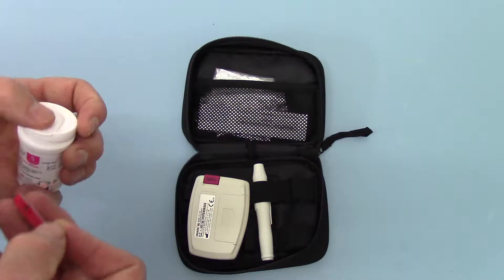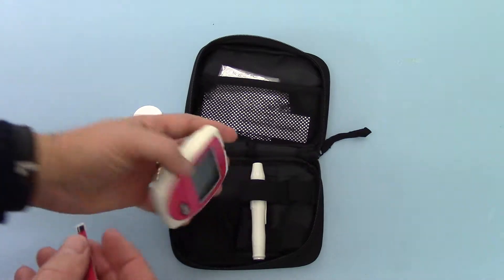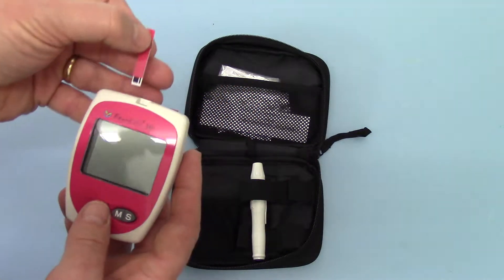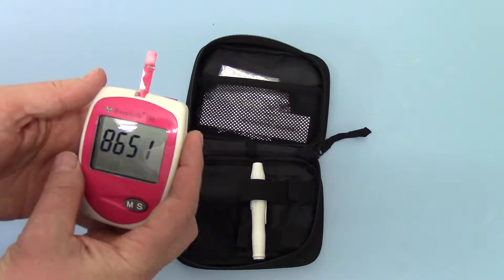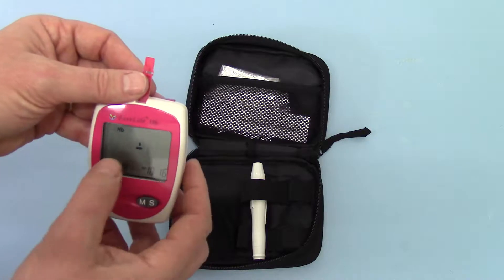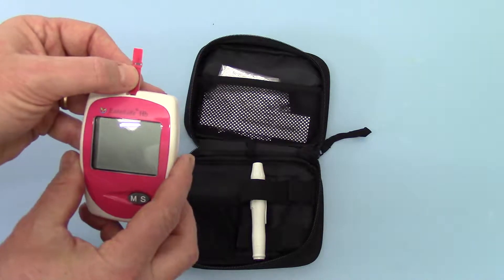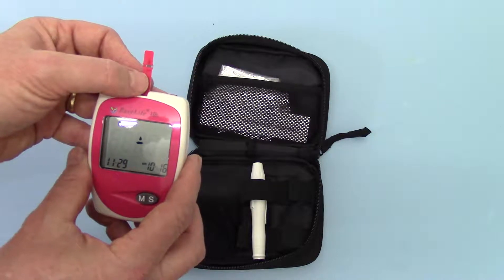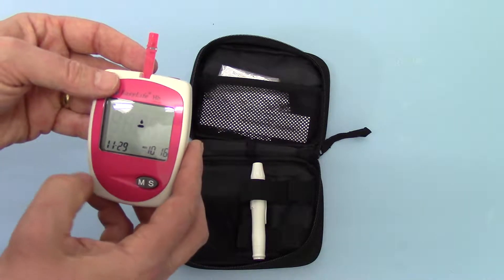One final check on this meter is by inserting a test strip into the top port. The code chip number is displayed and it's now asking for a sample of blood. And you've got the correct time and date there.